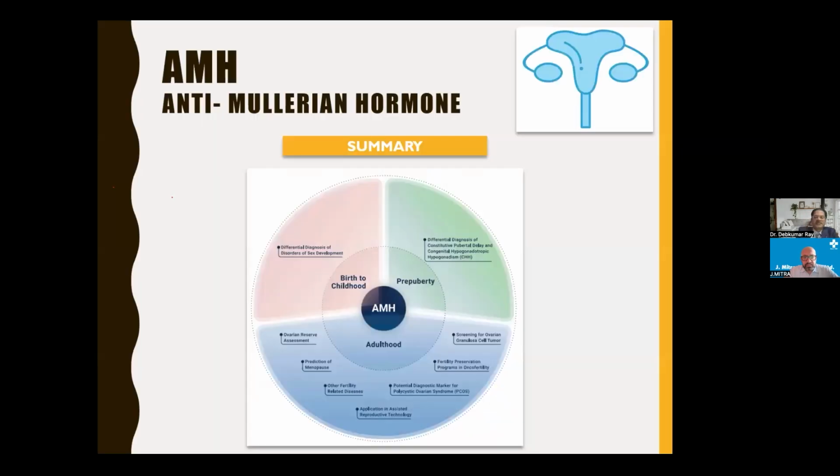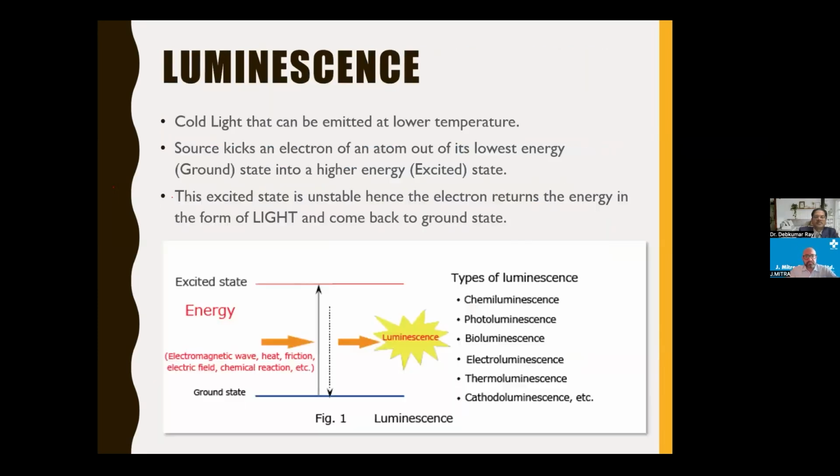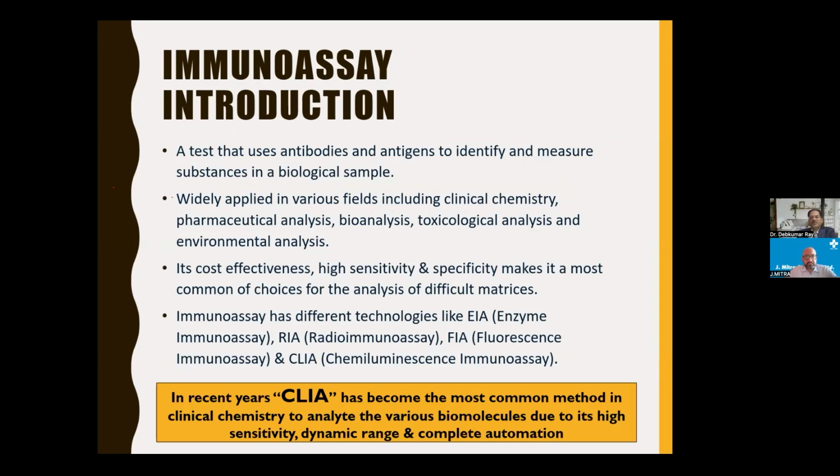So CLIA we have mentioned here, but there is limited scope to say everything about the different variants of CLIA. Grossly, we can say the flash CLIA is the more effective method. If you focus on the particular subvariant of CLIA, there are different types of CLIA. We are not focusing on that. We have a limited scope to discuss all this in this discussion. So that's why I would like to say you must prefer the first one.